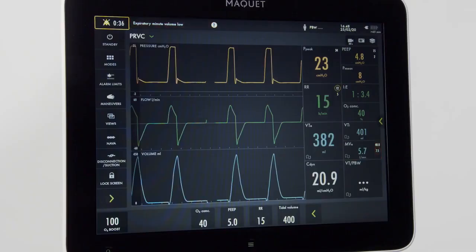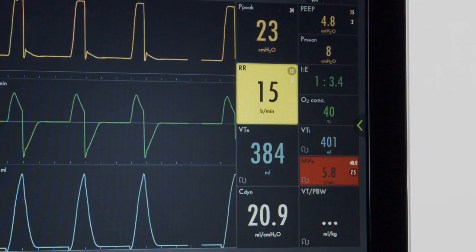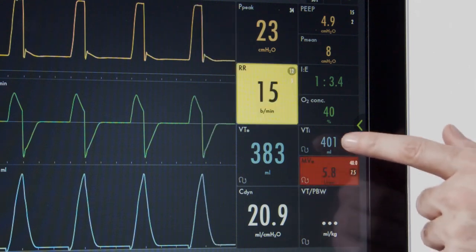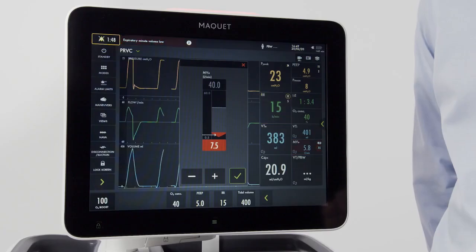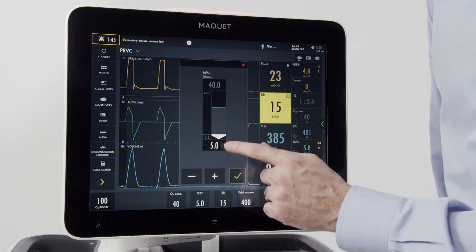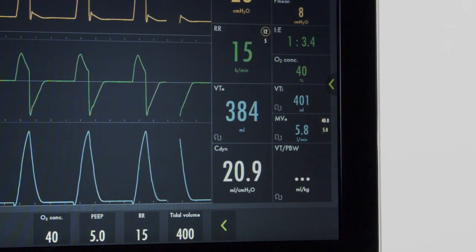In addition to the alarm information window, active alarms can be visualized on the measurement side of the screen. To address an active alarm, you can simply press the flashing measurement, which will take you to your quick setting adjustment. From here, I can set the screen, hit accept, and I've addressed my alarm condition.